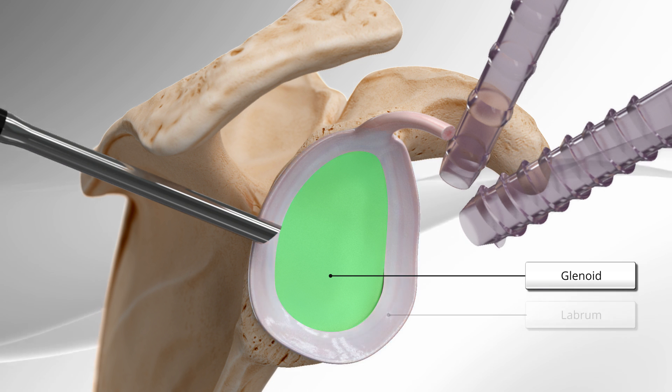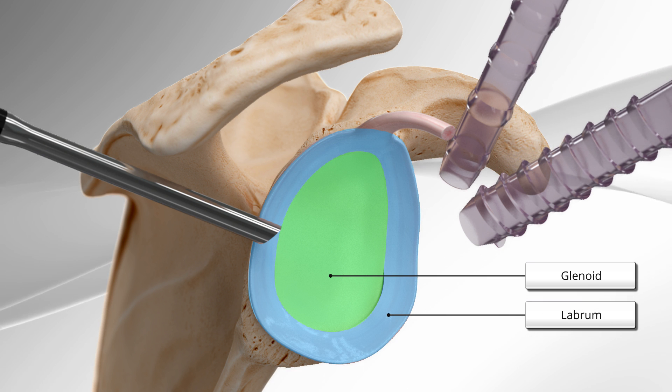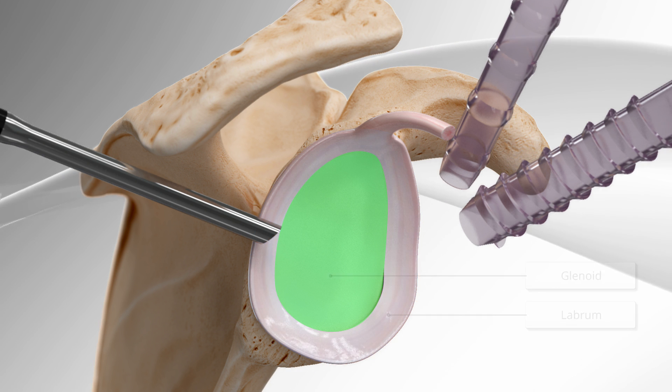In this procedure, we see the repair of the labrum, a rubbery cartilage material around the socket that helps maintain stability of the shoulder.